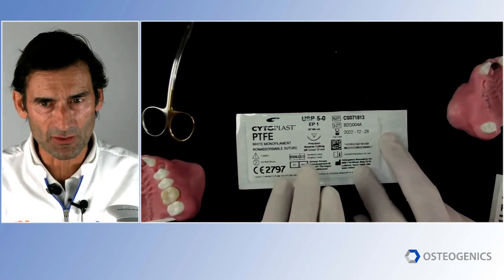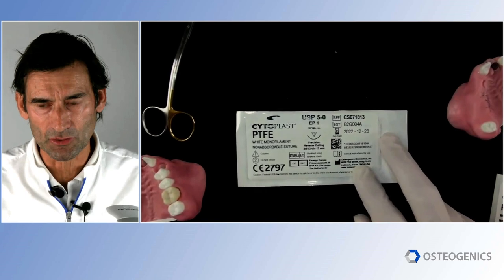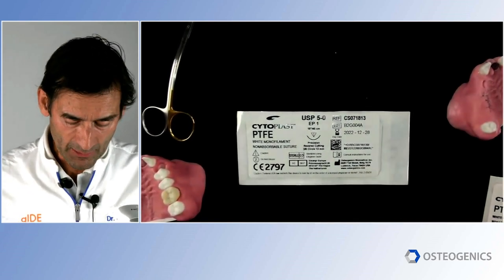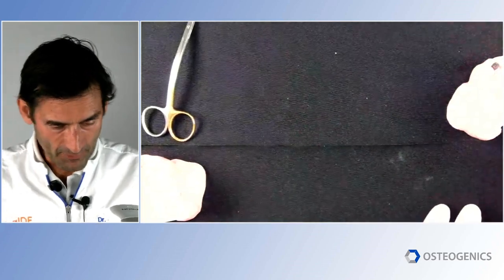I love this suture. So I will never complain to use a cytoplast or a PTFE suture. My go-to for flaps is usually a 3-0, but I can go to 4-0 and 5-0 at any time from a standpoint of management.